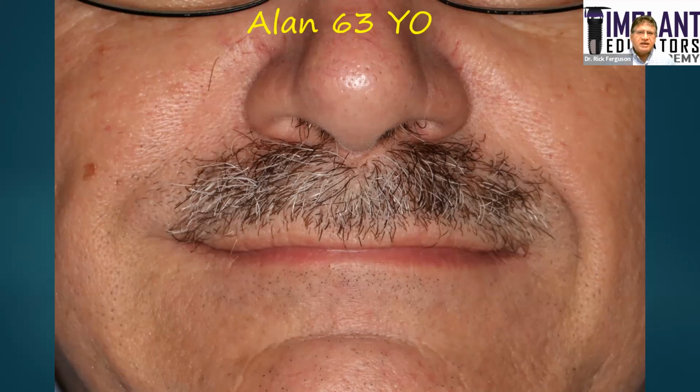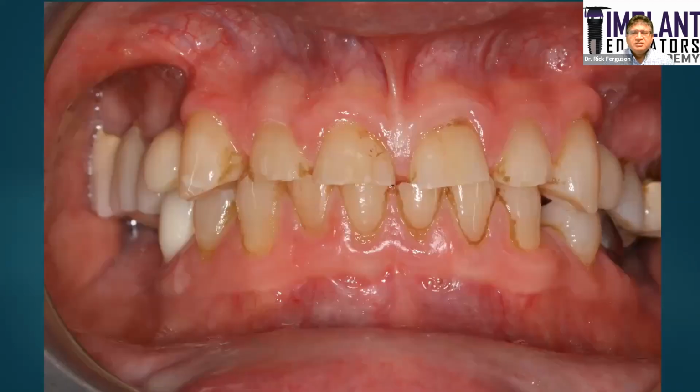So that brings us to Alan. So this is one of the first indications, I think, for doing 3D printing in office. Alan's 63 years old, and he presents with this dentition where he's lost his vertical dimension. He has a lot of wear on his teeth, and we need to do a full mouth rehabilitation on him. So now we have to sit down and talk about how we're going to accomplish this.